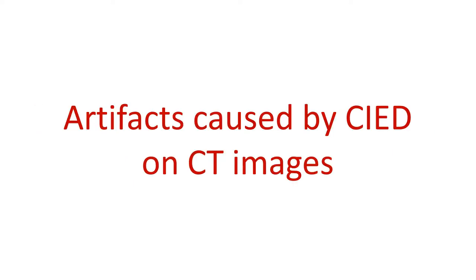Now, what about the artifacts caused by CIED on CT images? In a study of 15 patients undergoing CT along with positron emission tomography, no artifacts from pacing leads were identified, but significant artifact was observed in half of the patient studies with ICD leads. The authors suggested software-based corrections to be applied for accurate cardiac imaging in the presence of CIED.